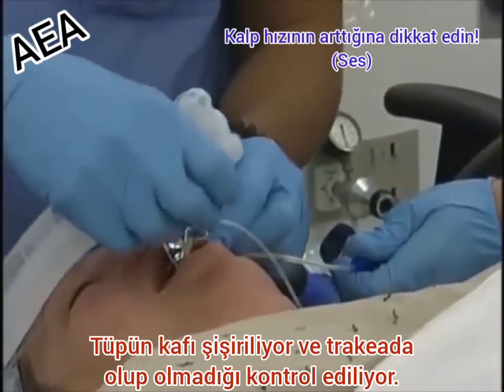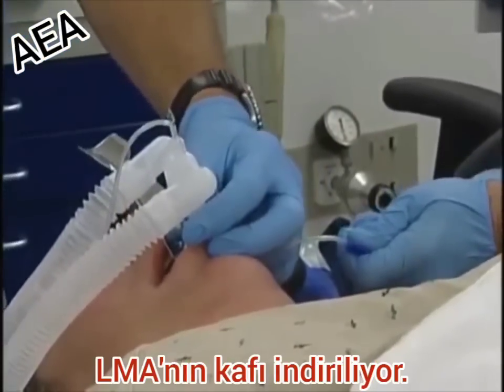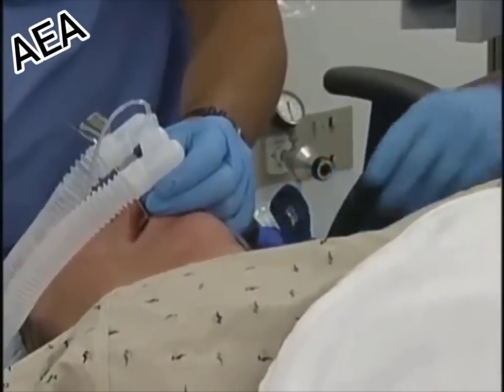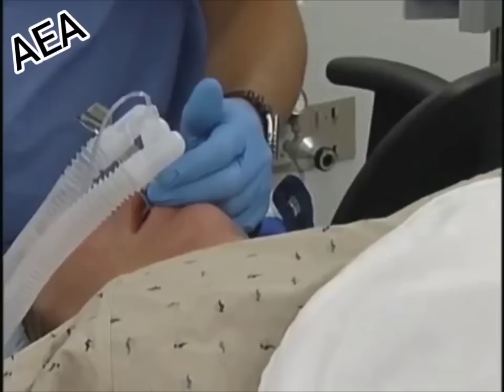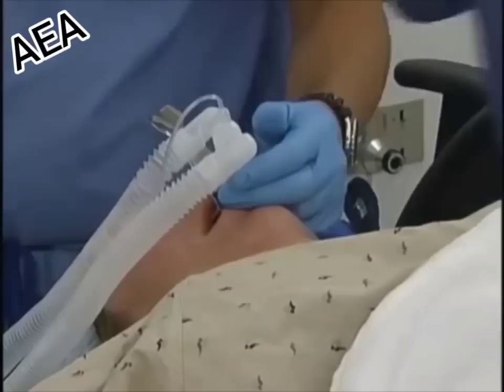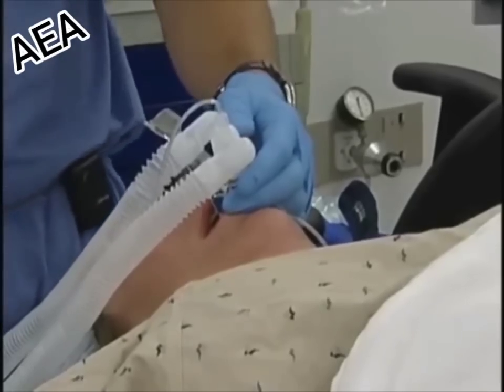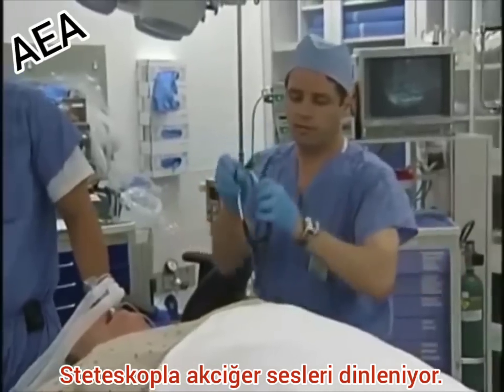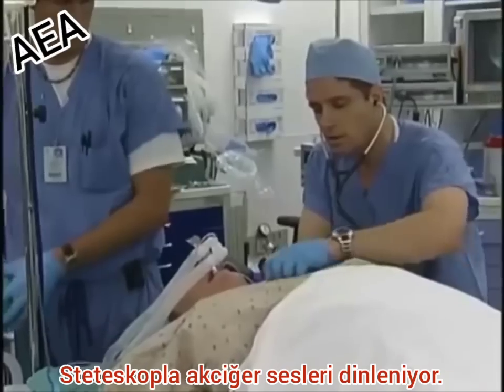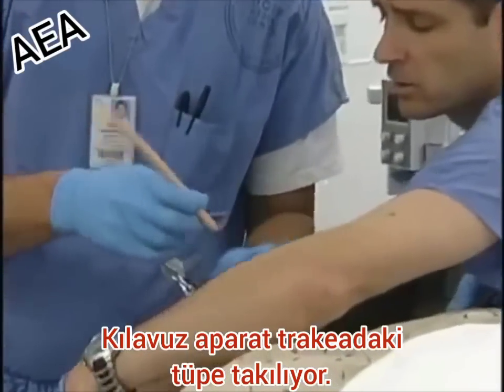I'm going to hook up and turn on the desk. We've inflated the endotracheal tube cuff and deflated the laryngeal mask cuff. She seems to be ventilating adequately — we've got end-tidal CO2. We can confirm that there are bilateral breath sounds. The endotracheal tube connector out.